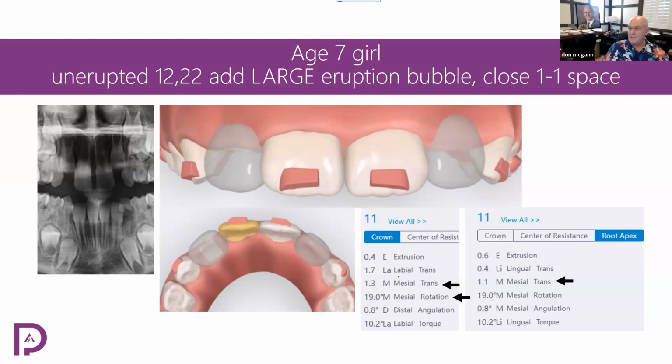Now we are committing ourselves to aligners, because you're probably not going to do a 20 tray aligner package for phase one and then have to transition them into brackets later. But you could. Chances are you're going to go unlimited, and there are issues there that we'll talk about.